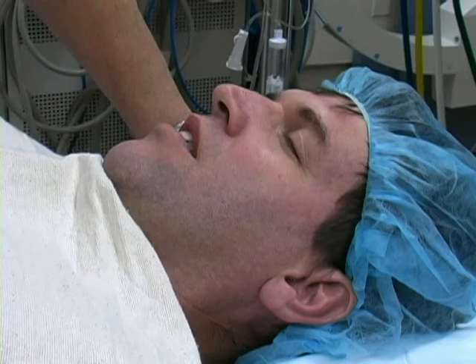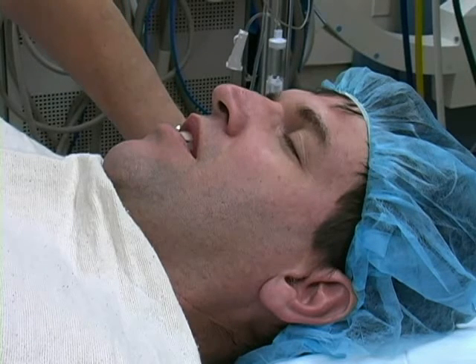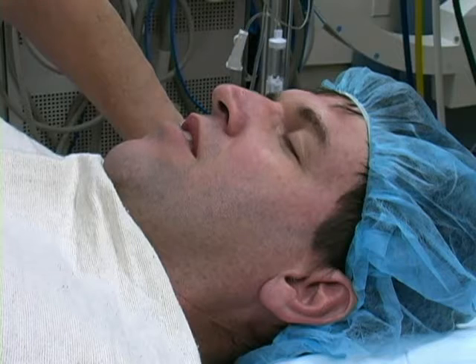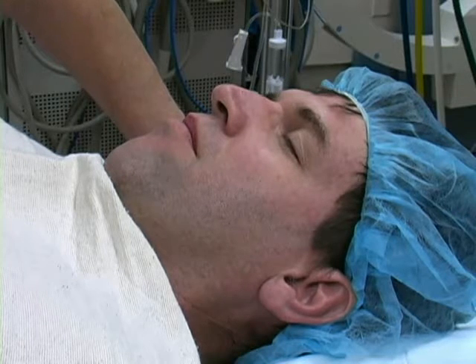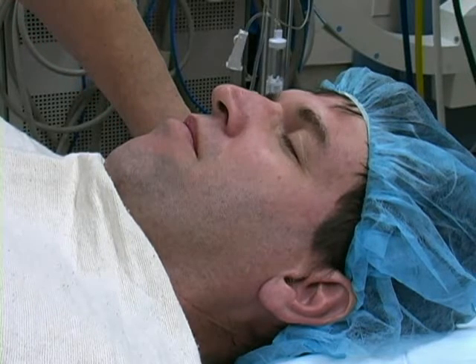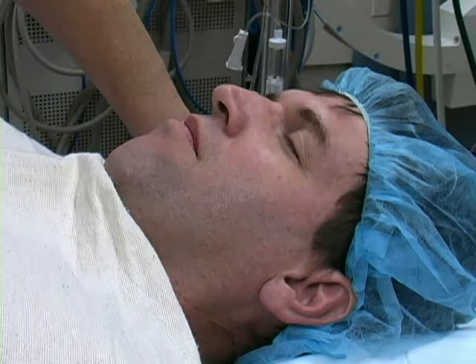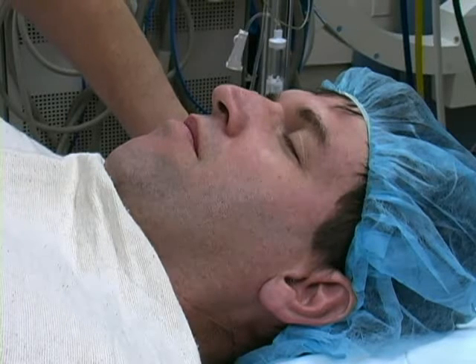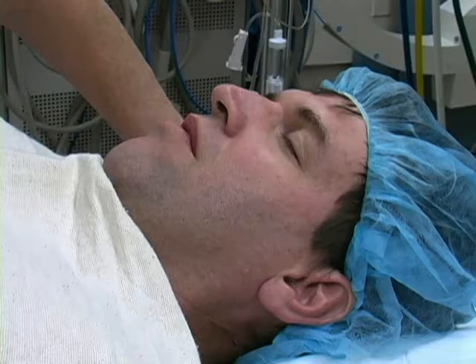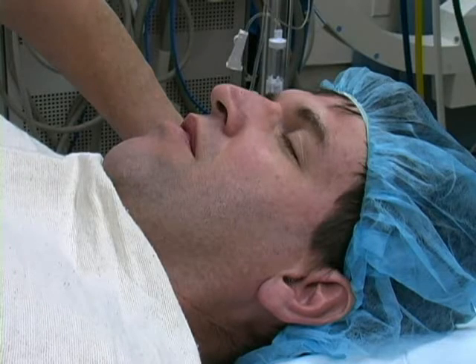The patient should be placed in a supine position with his or her head resting on a foam pillow. The head may be placed in sniffing position or, alternatively, because the view of the vocal cords is seen on the GlideScope monitor, the head may be kept in neutral position.